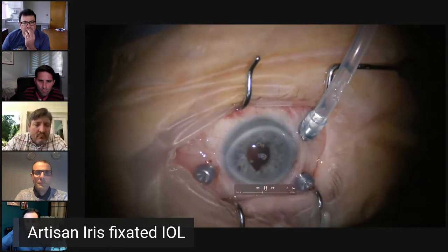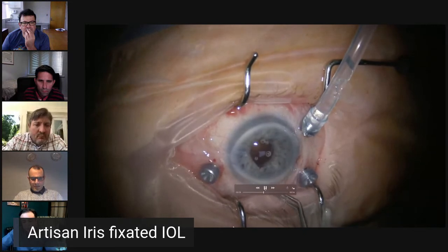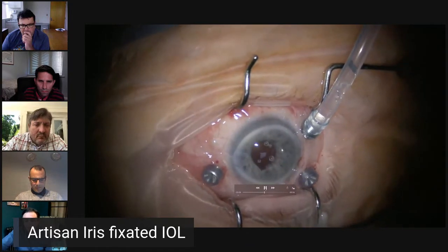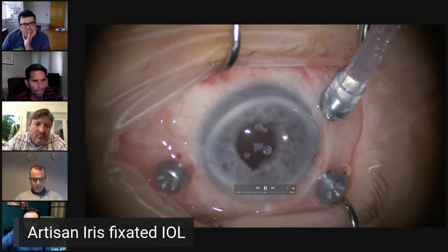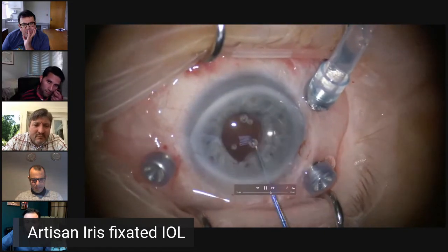Remember, I'm showing here that the lens is concave. So I'm putting the concavity away from the iris. So you need to remember to turn the lens upside down. And also remember that the A constant calculation for this type of introduction is going to be different from the normal artisan lens that we introduce in the anterior chamber. Once it's in place, you dial it wherever you want to dial.